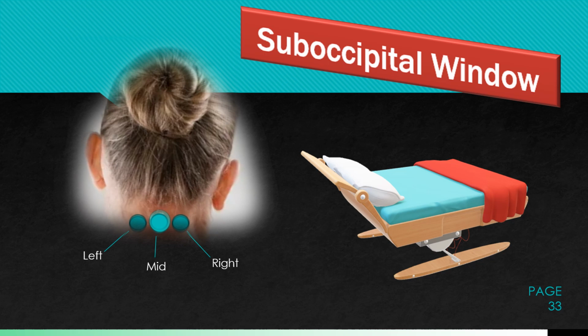The suboccipital window is very position dependent. There are times that I have scanned and you just can't find the suboccipital window. Your probe is not lined up accurately. In situations such as this, reposition your patient.